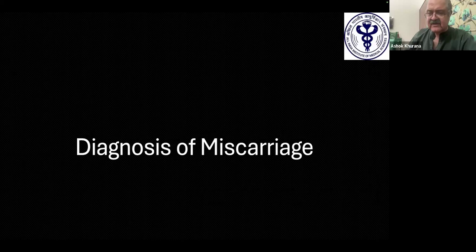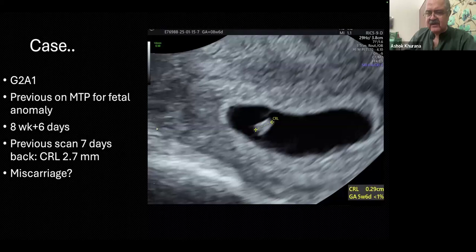That's right. Most of these are actually unobliterated uterine cavity, and there is no doubt that we should not attach importance to them. Anyway, we understand that most subchorionic hemorrhages will not be directly responsible for a miscarriage, that the hematoma is a consequence of the miscarriage and not the cause. And that is why we don't touch them anymore. Once upon a time in Sweden, we were emptying them out. And now we realize that's of no consequence. So it's not that they are causative at all. So we don't attach importance to the size or the presence of a hematoma.